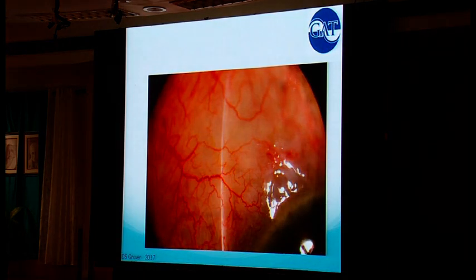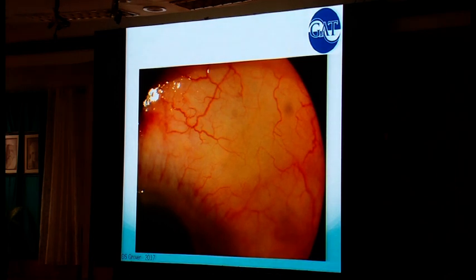All right. Yeah, exactly. So this is the classic bleb that you see. I mean, bleb morphology is bleb morphology. This is the dream bleb morphology, but you'll see variations of it. But you see that low diffuse bleb, and you can see the implant right here.